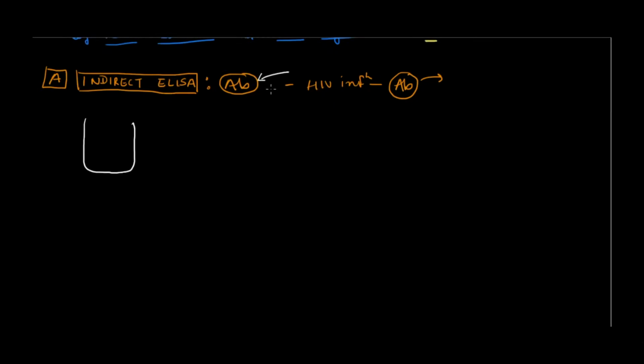So what we need in lab is a protein or antigen similar to HIV virus, maybe envelope protein or some core protein, so that this antibody, if at all is present, would go and bind it. So my first step would be to have recombinant HIV protein. Maybe let's say for example I might take core protein, or maybe envelope protein, anything.